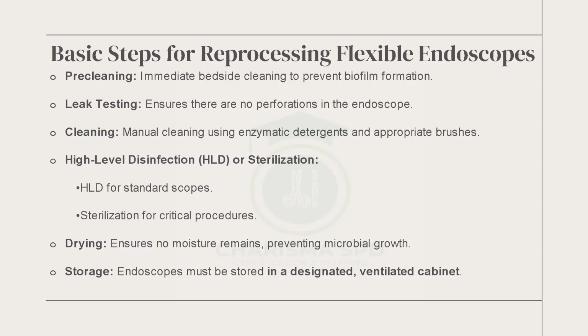So the leak test is very, very important, and the Joint Commission has been asking about that. If they come to meet you in decontam, in a Joint Commission survey, they are going to bombard you with a lot of questions. And you should expect a question on scopes.